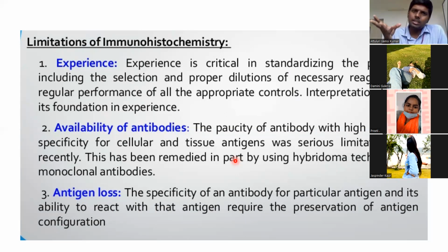There will be many errors because they don't know the level of sensitivity they are dealing with in the tissue. Simply, we might think we are adding reagents. No, even the reagent concentration, the way you are adding it, your pressures, your temperatures, the tissue status, everything needs to be considered in immunohistochemistry. Very, very sensitive methods. So experience is important.